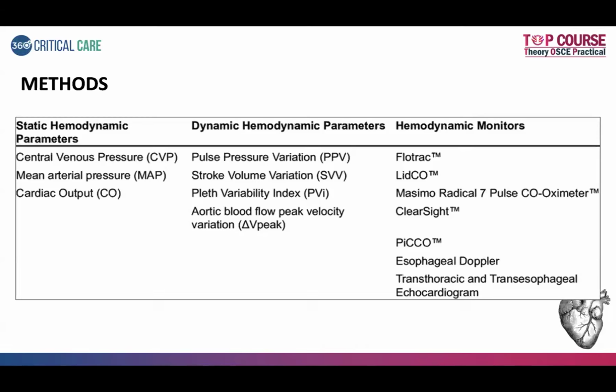Some of the common hemodynamic monitors which we use in our ICUs, the commonly used named ones, are FlowTrack, LiDCO, PiCCO, VolumeView, and Echo.